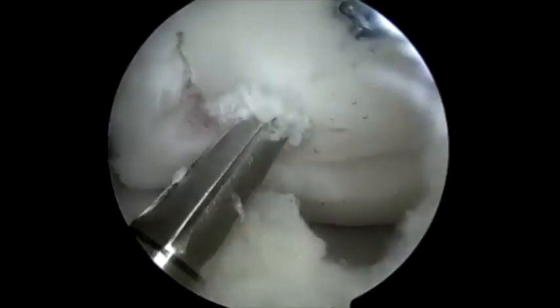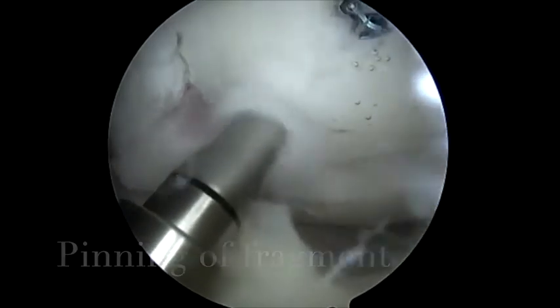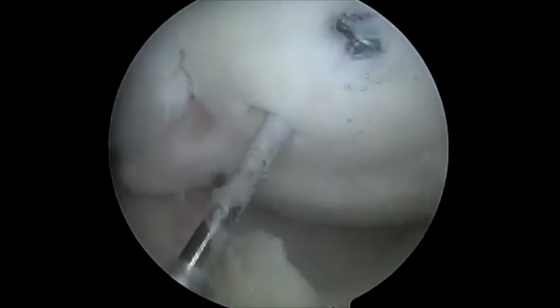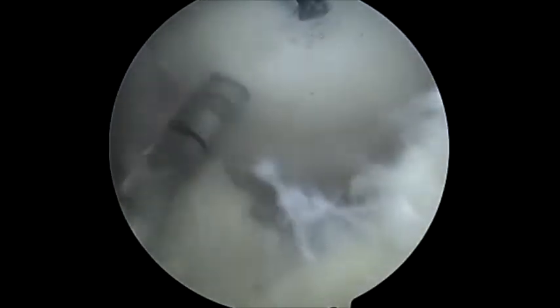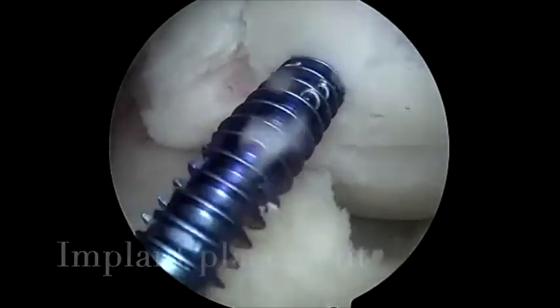An arthroscopic shaver and curettage was used to prepare the surface of the lesion. We then proceeded to pin the fragment by introducing a small K-wire through the trans-patellar portal. The fragment was then drilled and tapped perpendicular to the surface of the lesion. A mini headless compression screw was then inserted and tightened into the fragment.